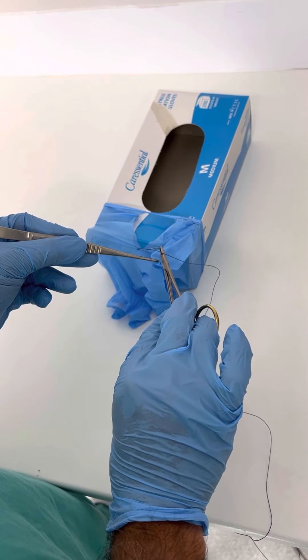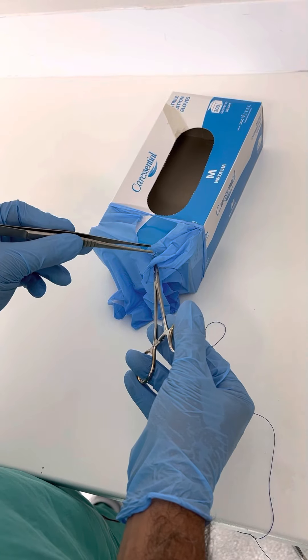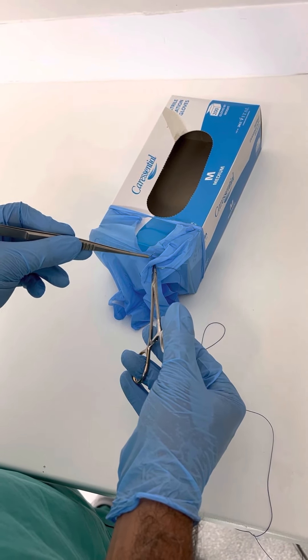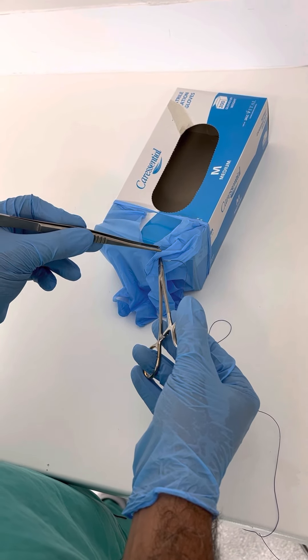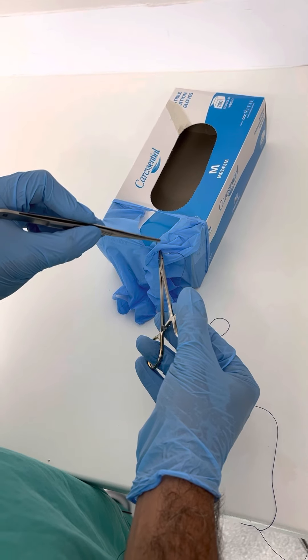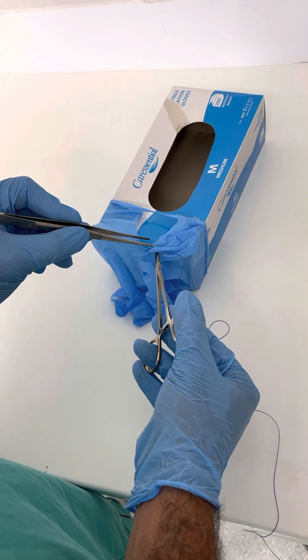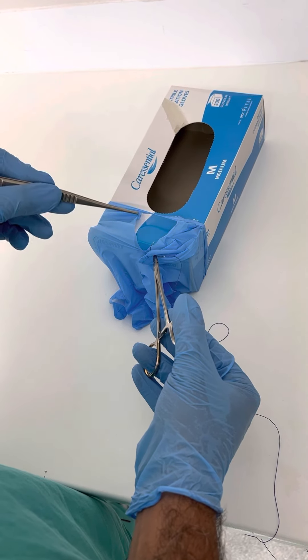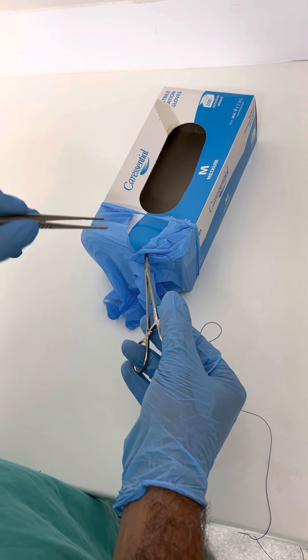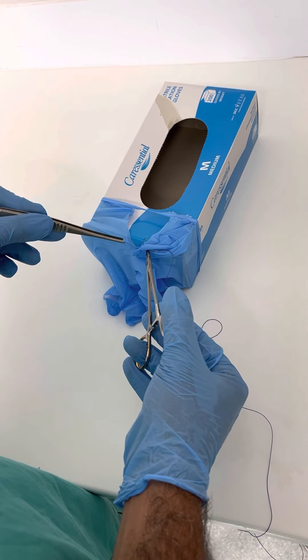I'm going to go in here and take the first bite. Notice that I'm not going to grab the tip of the needle, because if it's a cutting needle you don't want it damaged. It's best not to touch the tip of the needle because if the tip gets damaged, subsequent suturing can be affected — you'd have a ragged, damaged piece of metal creating more scarring for your next suture.